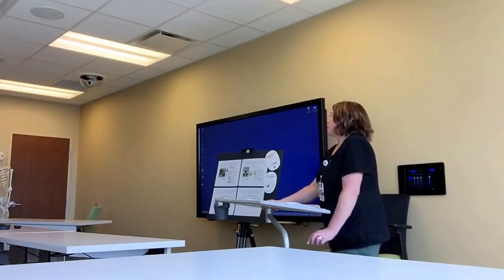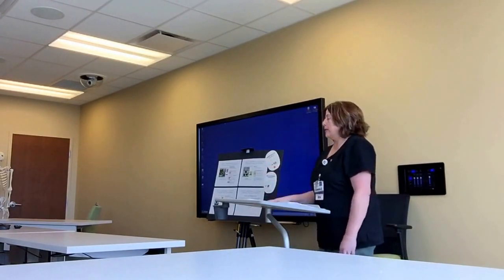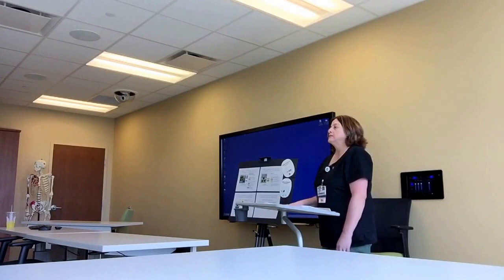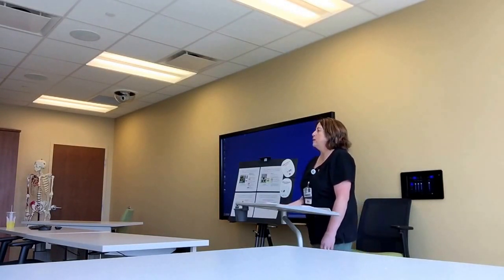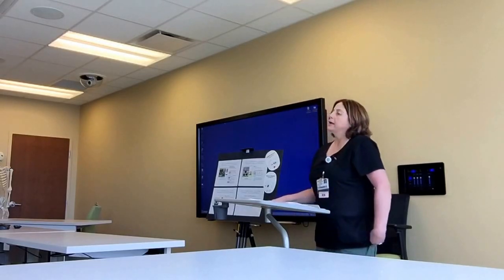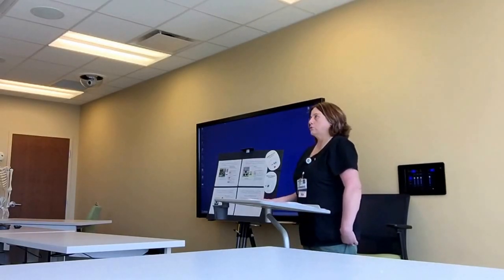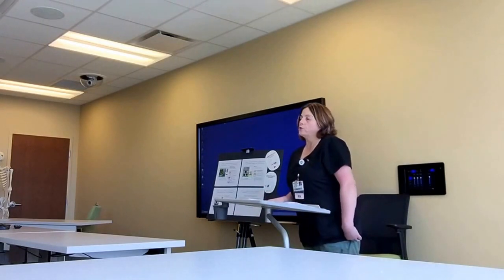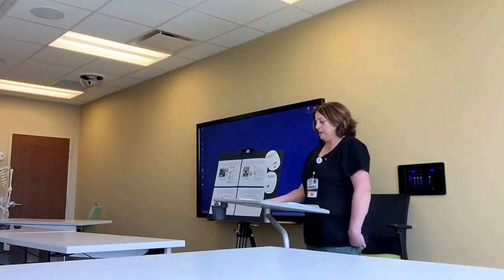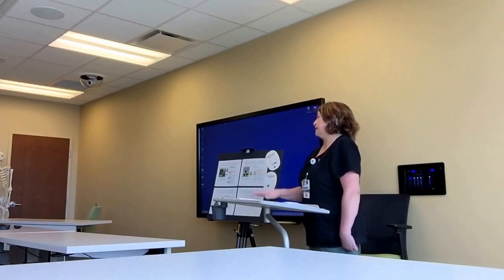Set your monitor on defib, and then we're going to set the joules for 50 to 100 joules, depending on what the doctor would like to do. And we're going to let the patient know that we're going to cardiovert them. We need to put the sync button on and cardiovert, do an EKG afterwards, or possibly re-cardiovert the patient if it doesn't happen.